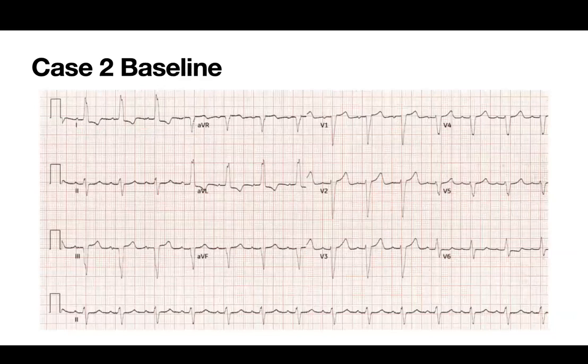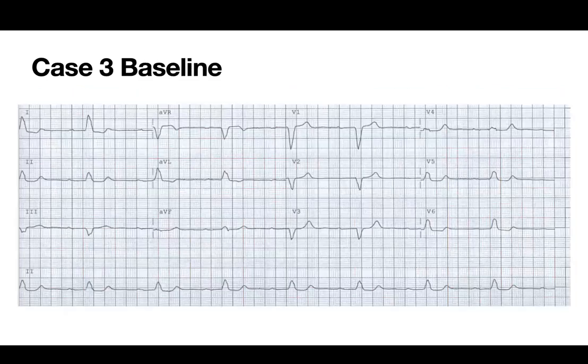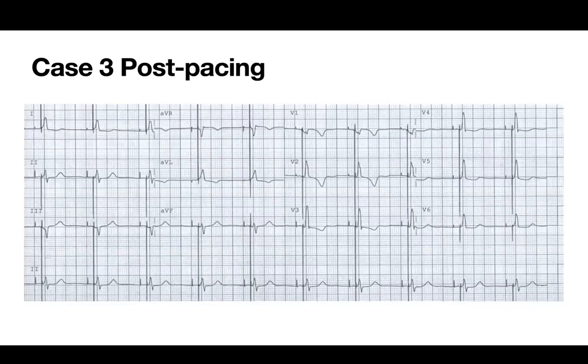Okay, next. This is another case, QRS about 140, syncope, low EF around 40. And go next. You get a narrower QRS. Next. This was done by my colleague, in long PR, left bundle branch block. There's a double peak here in AVL. Go next. Again, you get a fairly narrow QRS.